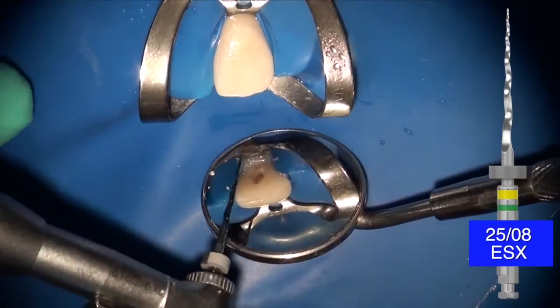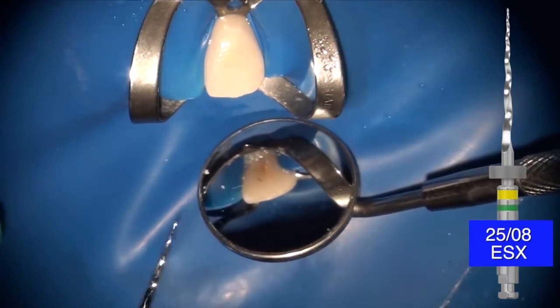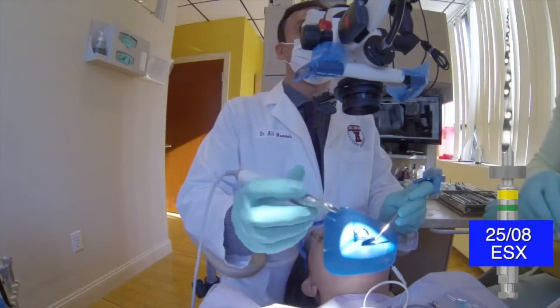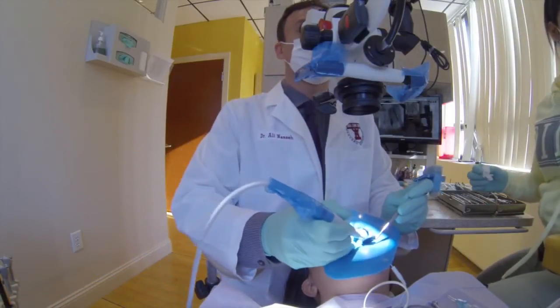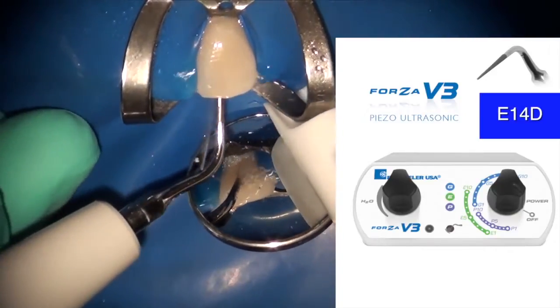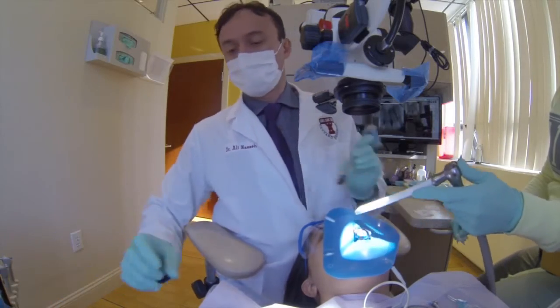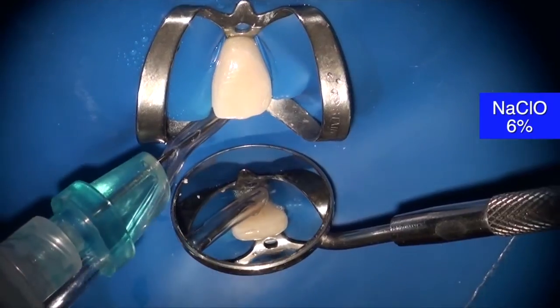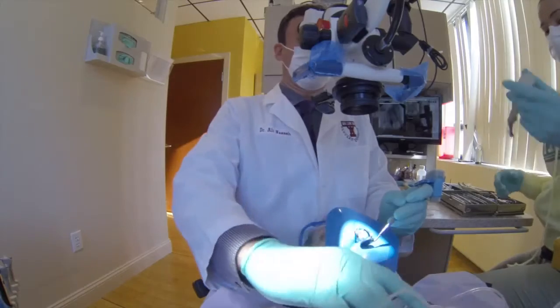Now I'm using the 2508 ESX file, which is the orifice opener, doing it one or two strokes only, followed by wiping by my assistant. What that does is basically a version of your SSC motion, which removes the debris from the file, and I follow that immediately with the ultrasonic again. Ultrasonic in water is the most efficient way to remove debris that has been cut in the canal. I then proceed to place a little bit of hypochlorite in the root canal — I use 6% full-strength hypochlorite.